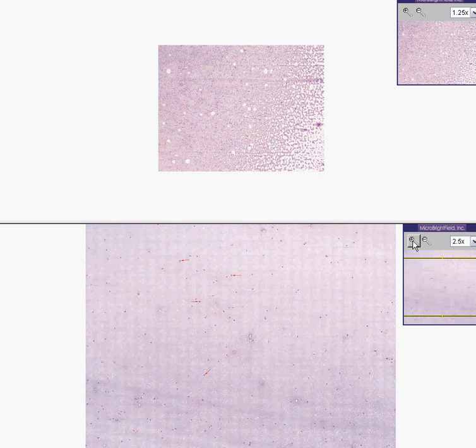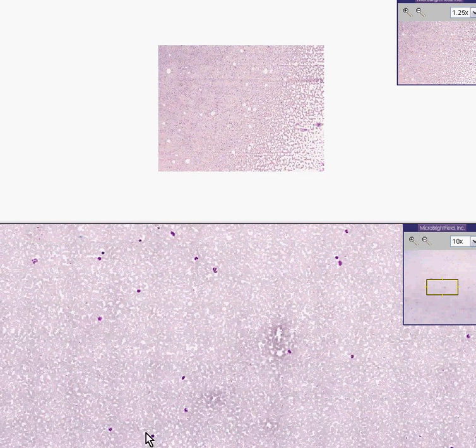And let's take a look at a normal peripheral smear. I'm going to make 3 clicks on the normal peripheral smear. 1, 2, 3. Even though we haven't identified all these cells precisely, I want you to get the general feel for the ratio between the white cells and the red cells. There's probably 30, 40 at most white cells in this area, and all the rest of them are red cells. It looks like it might be 100 or 1,000 to 1 ratio.